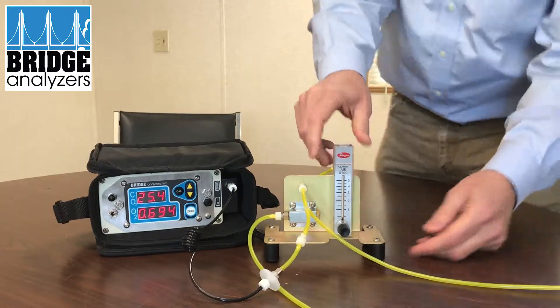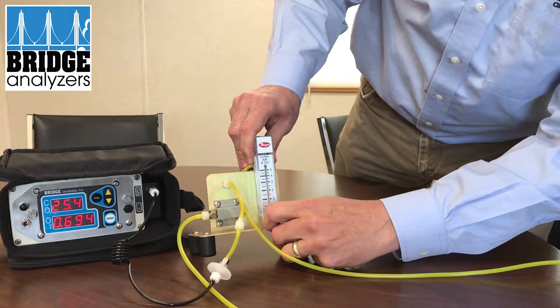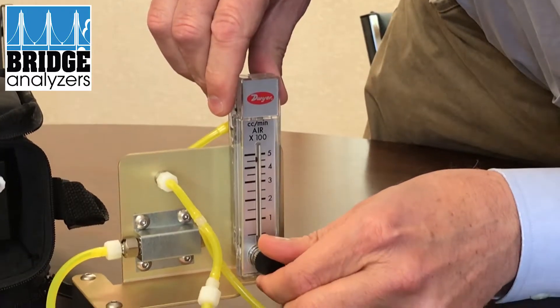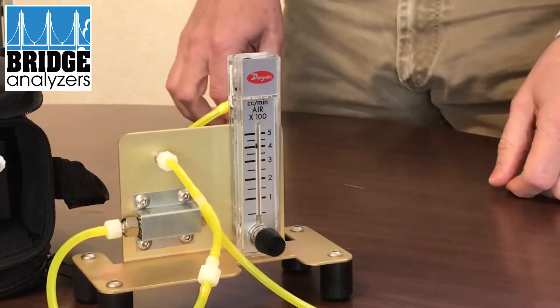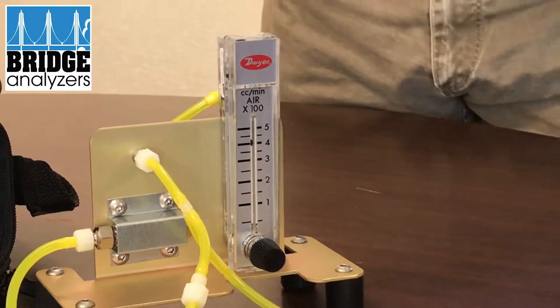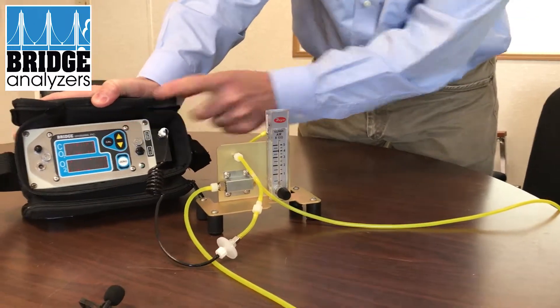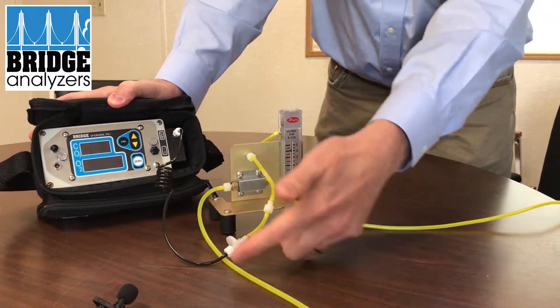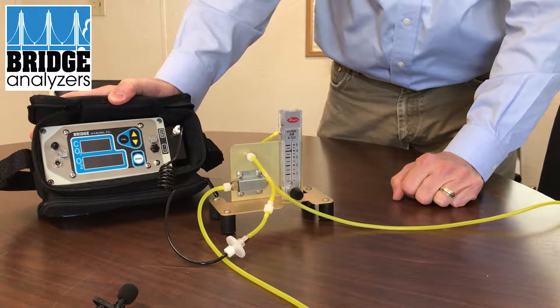I'm going to set a flow rate of around 400 — that's about 400 cc's a minute — and we're going to flow it. Right now it's just overflowing out the overflow port, and then when I hit test, the analyzer will just draw in a portion of that flow.